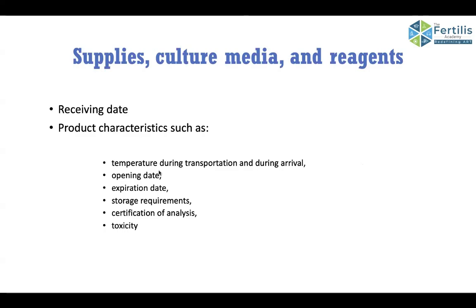If you look at the supplies, culture media, and reagents, we have to write the receiving date of these supplies, and also we have to look for the logistical changes. What was the temperature during transportation and during arrival? What was the opening date of this media? What is the expiry date? How soon could you consume the media? What are the storage requirements? Should it be exposed to light or kept in dark? There is also a certificate of analysis which is provided. So there are many minute details which you have to pay attention to.